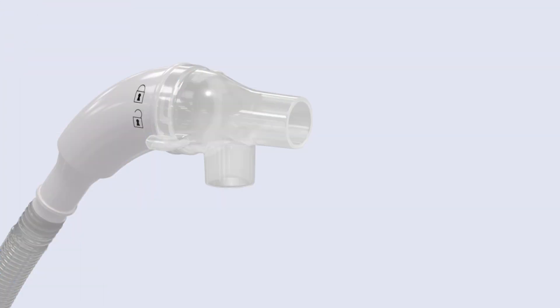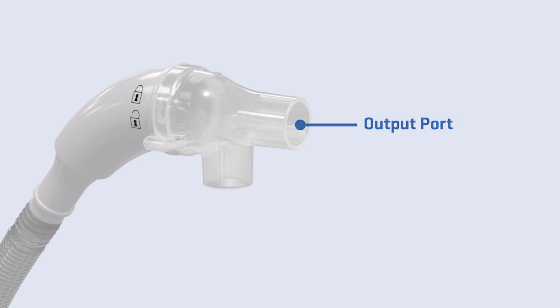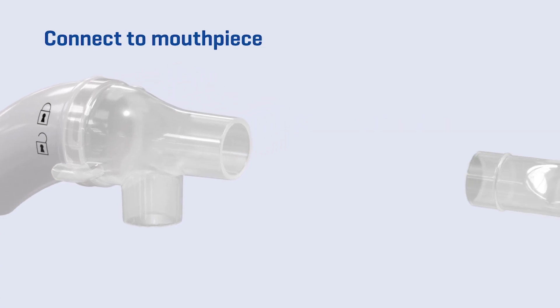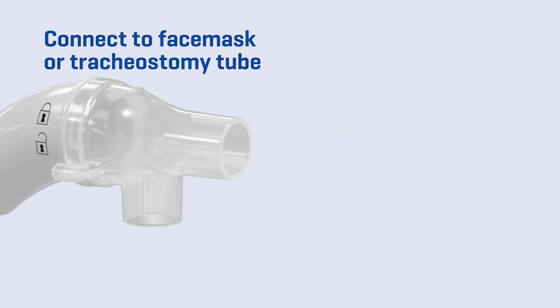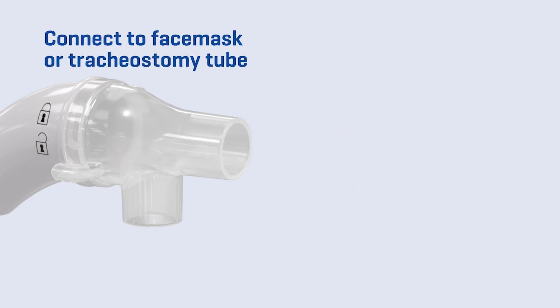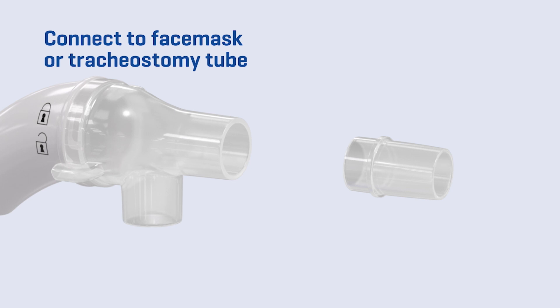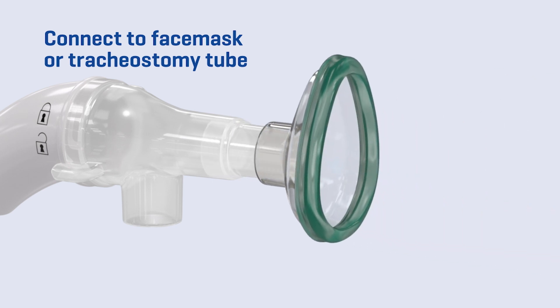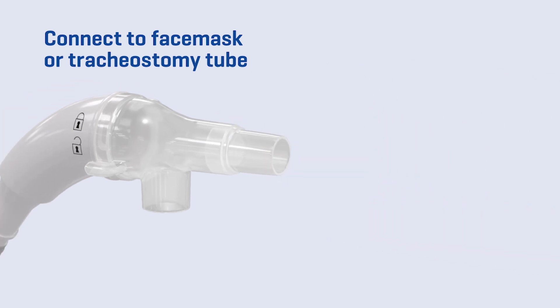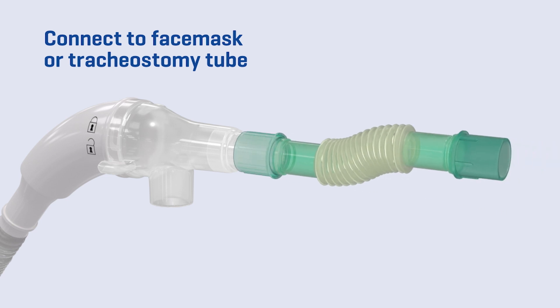Attach the appropriate patient interface to the output port of the clear spontaneous breathing adapter. For the mouthpiece, simply insert and gently twist into place. For the face mask or tracheostomy tube, first insert the adapter into the clear spontaneous breathing adapter, then connect to the other end of the face mask or tracheostomy adapter.